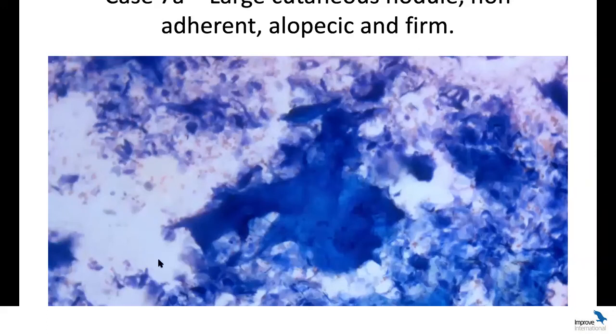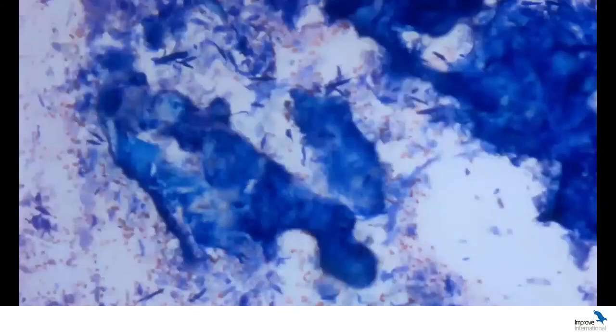Again, those are my red blood cells there. So this is from a high-end magnification. So when we zoom in, we can see that we have a lot of these keratin scrolls, and I'm sure that we all recognize these from our derm tape strips type of thing. We also had some pieces of hair shaft here. That's a little bit of hair growing.